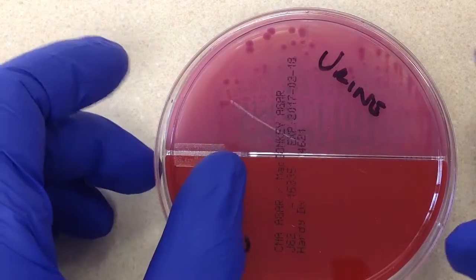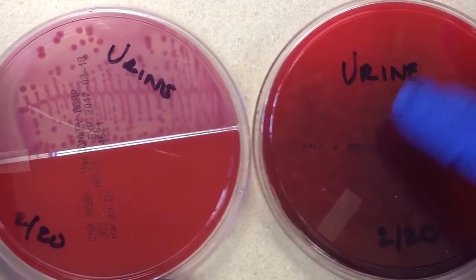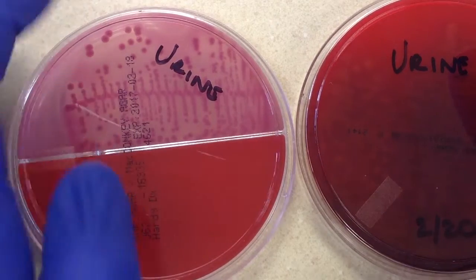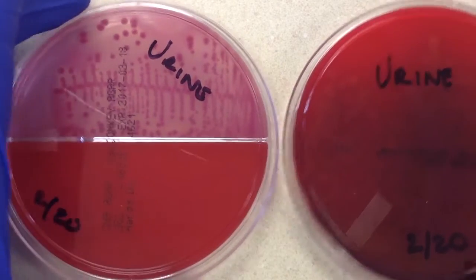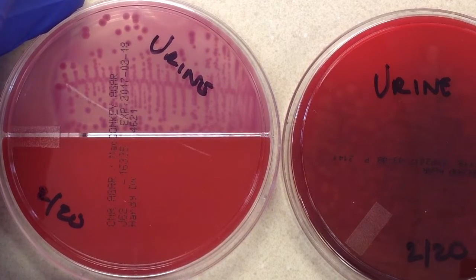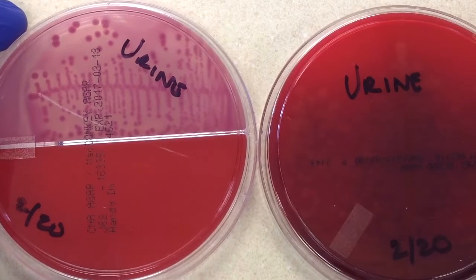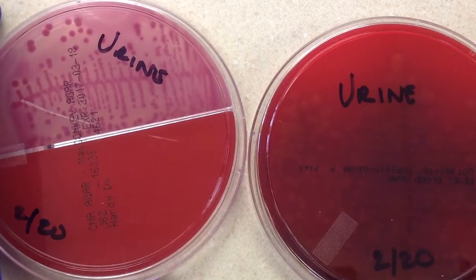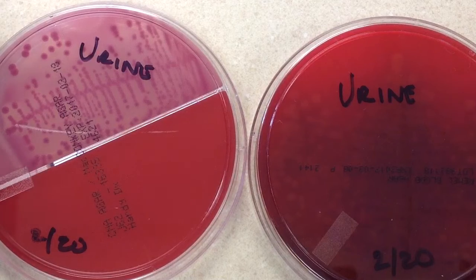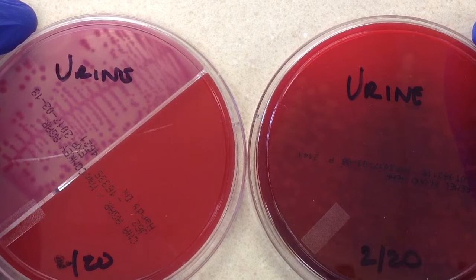Generally when a urine is set up, it's set up on two plates: a regular five percent sheep blood plate, and a bi-plate with MacConkey's and CNA. When this is set up it's used with a calibrated loop — you can either have a calibrated loop that is one one-hundredth or one one-thousandth of a milliliter — and the reason we do that is because the doctor needs to get a general idea of how much bacteria is present.